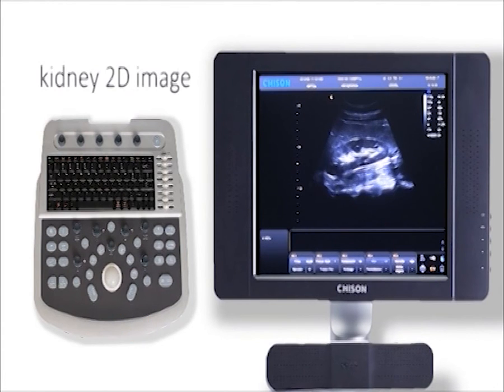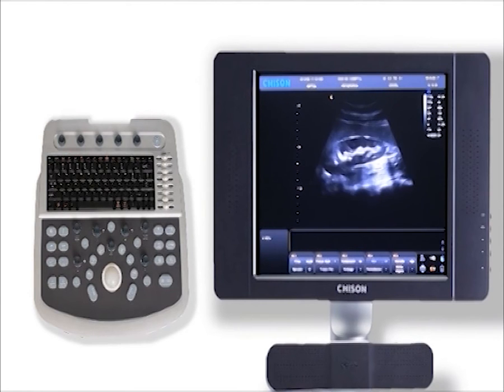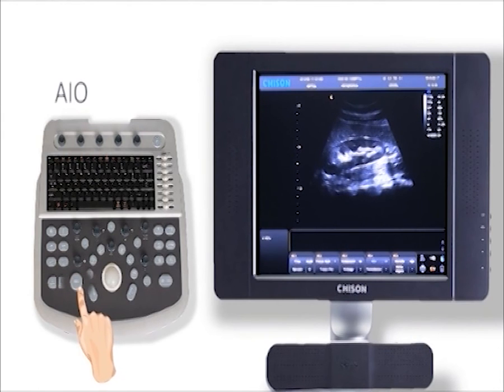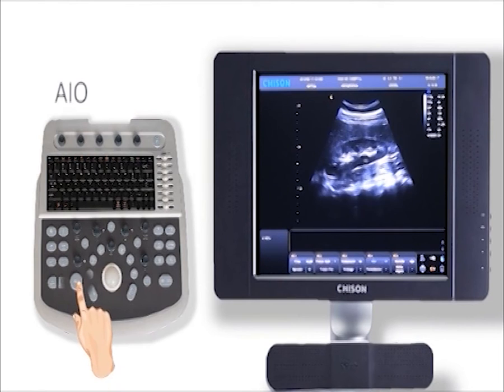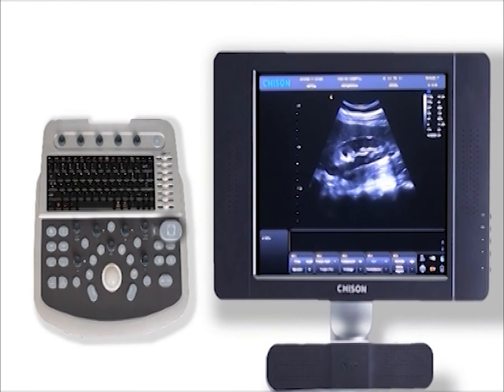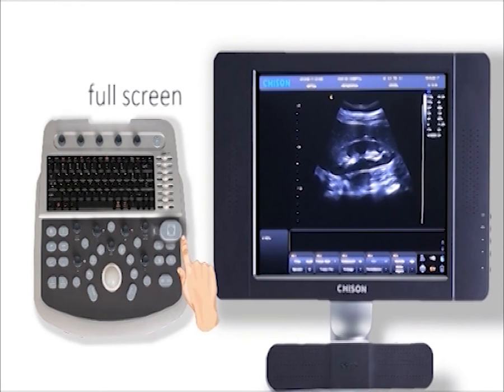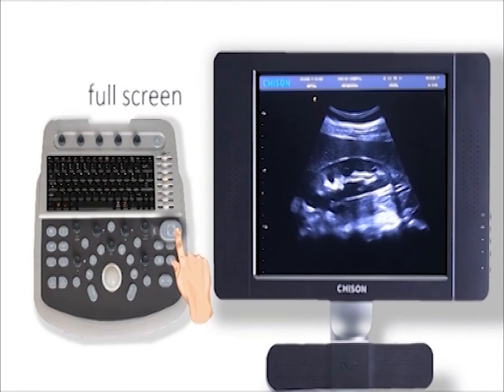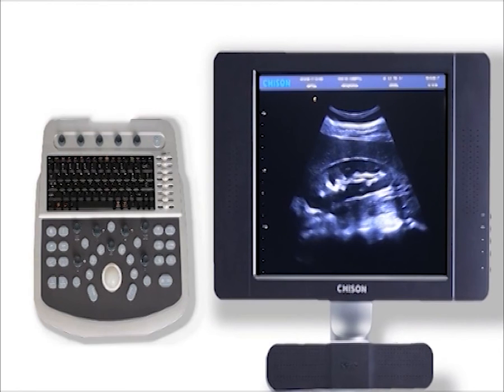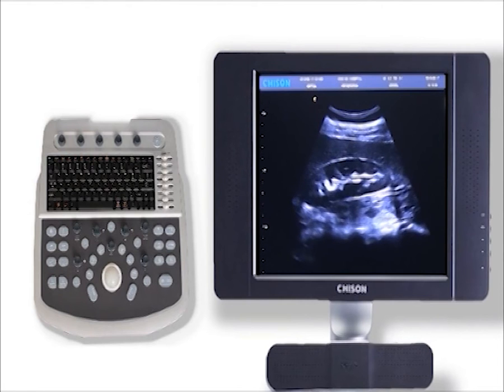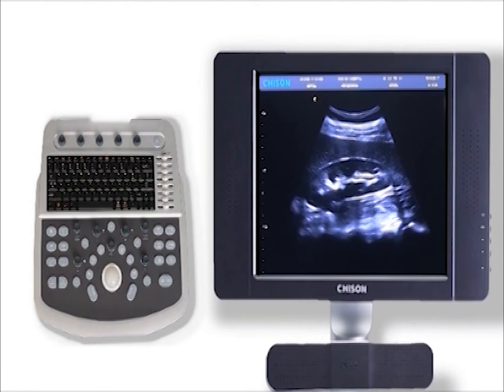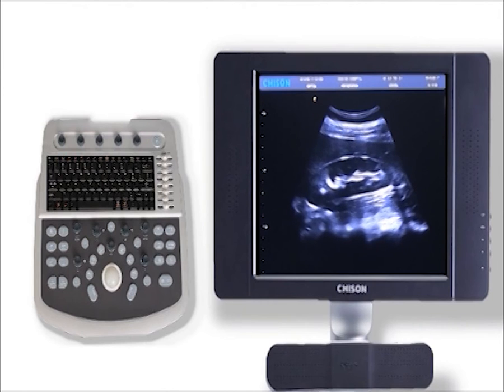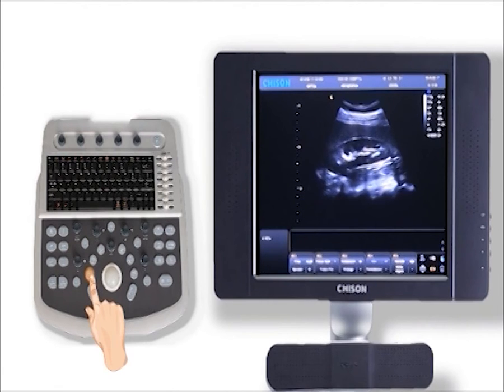Let's get started with a kidney 2D image. Now we can get an image on screen. Here is AIO — Automatic Image Optimization. According to the real situation, press it to reach an ideal image level. Press this key to open the one-key full screen display function. It will expand the vivid image area with high resolution. Press exit to go back to normal 2D image.